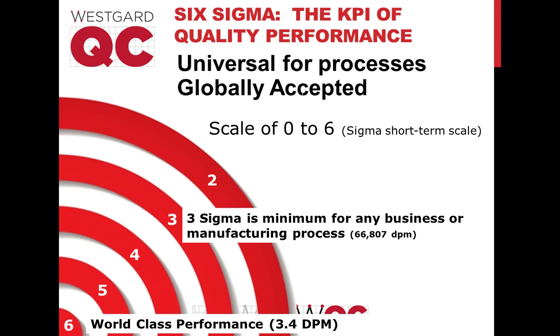There's a little bit of individual details for each kind of test. Hematology is different because of the short shelf life of hematology controls and some of the indexes, but there are adjustments that we can make on how we apply sigmametrics in those scenarios.